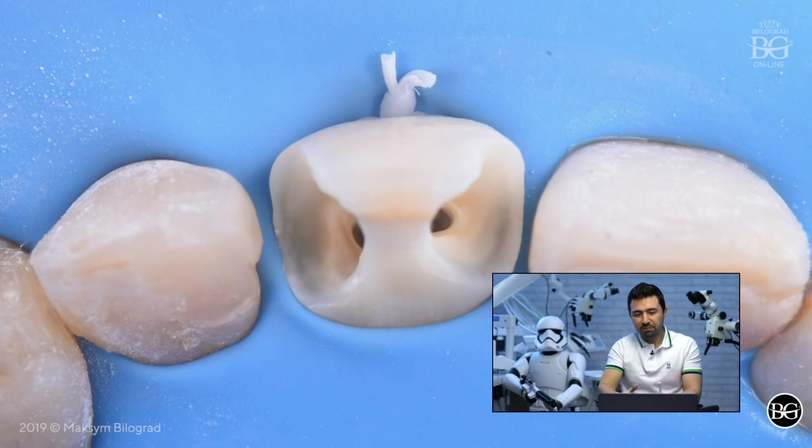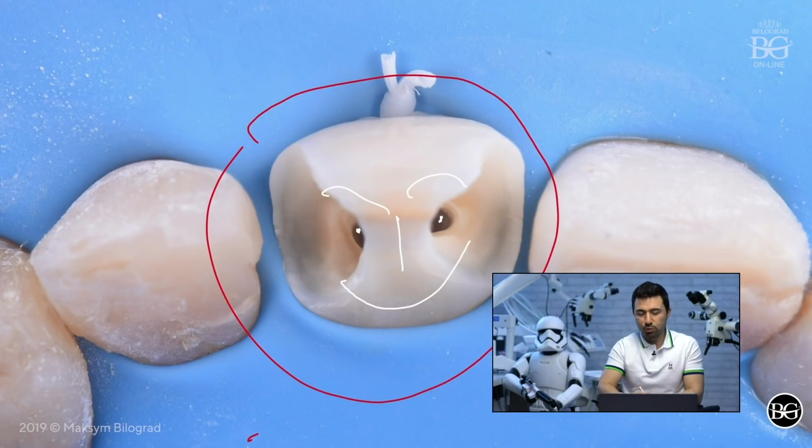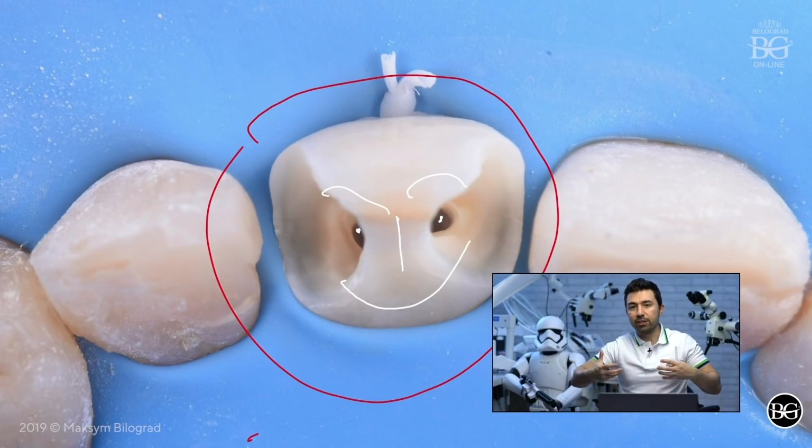So look, this is the view for access after endodontic treatment was finished. Pretty nice, tons of enamel preserved. The tooth is happy, as you can see here, because we have tons of sound tooth structure preserved, and in this case we don't need to put a post, we don't need to do some extra retentive preparations, because we have dentin and enamel to be bonded to.